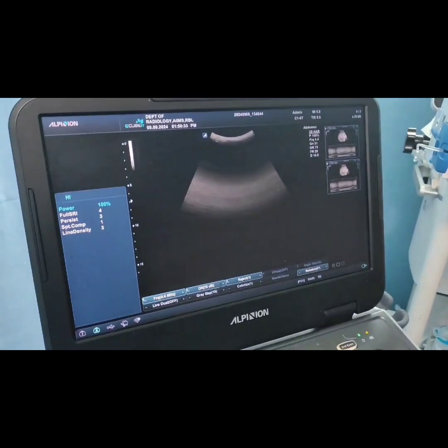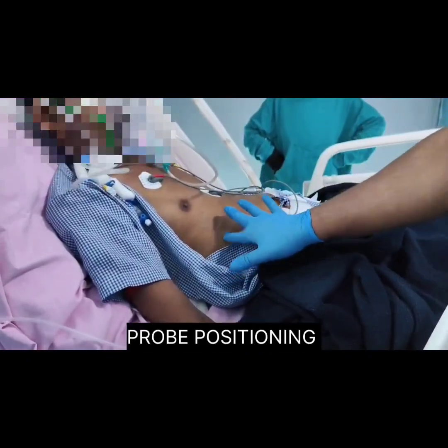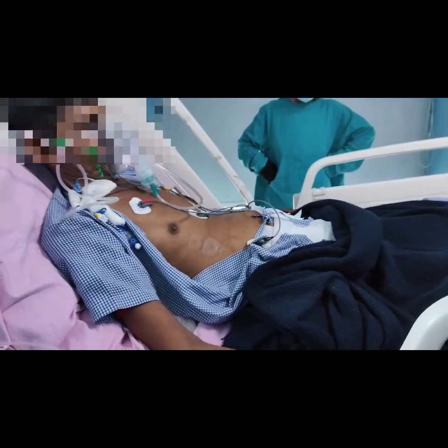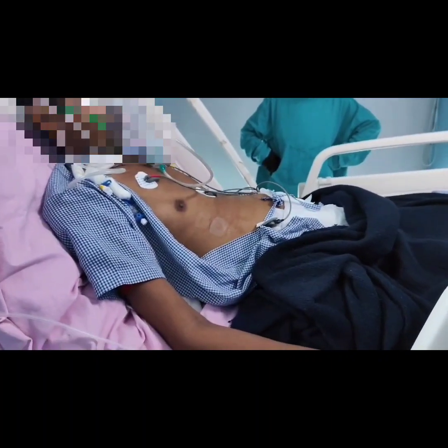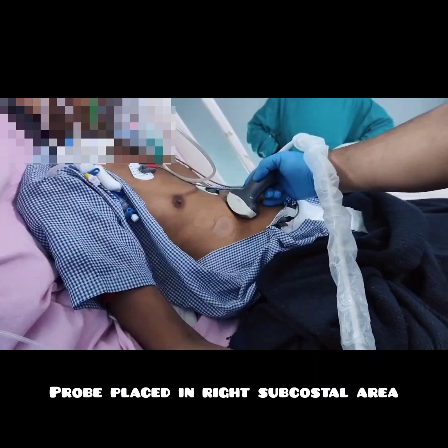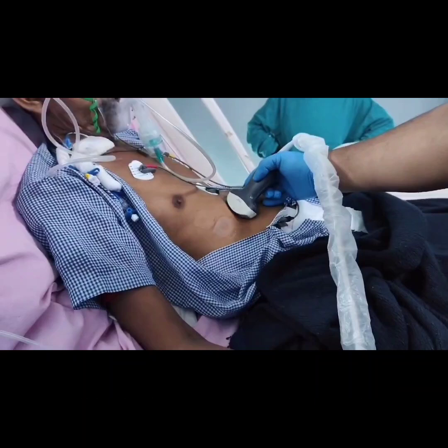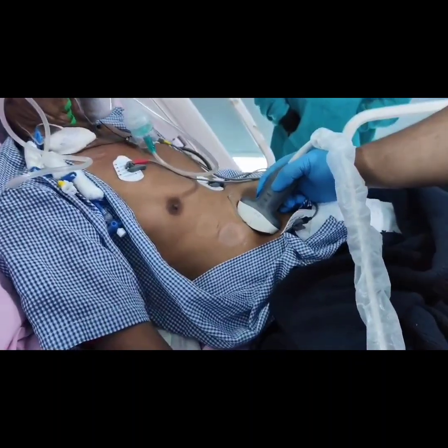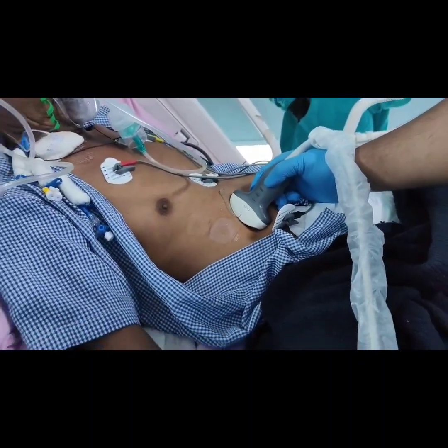We will place the probe on the right subcostal area. We can use both right as well as left subcostal area to see the respective hemidiaphragm. Here we have placed it in the anterior subcostal area. We can use the posterior subcostal area also, but for the patient's comfort we have placed it anteriorly.